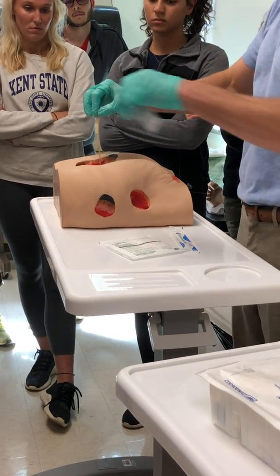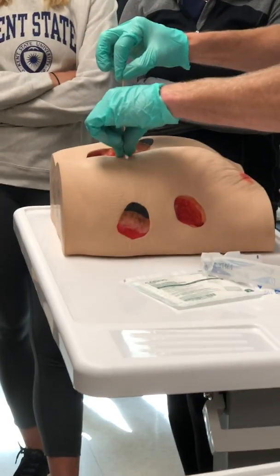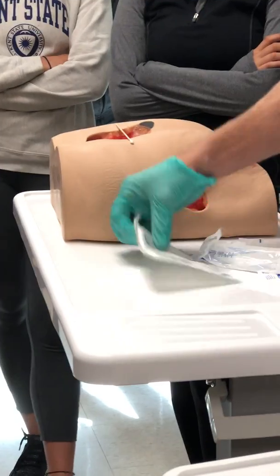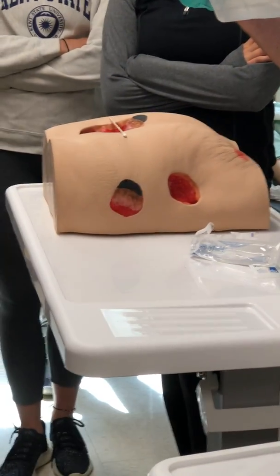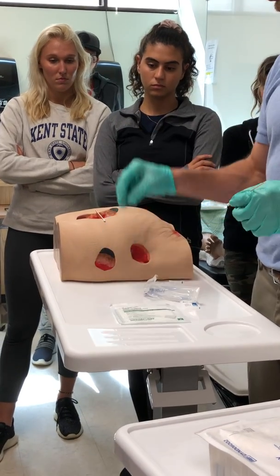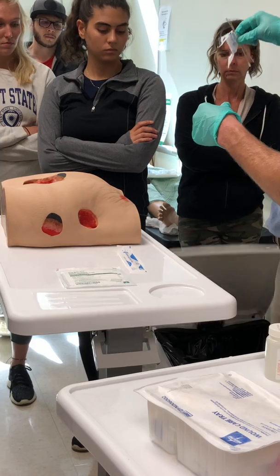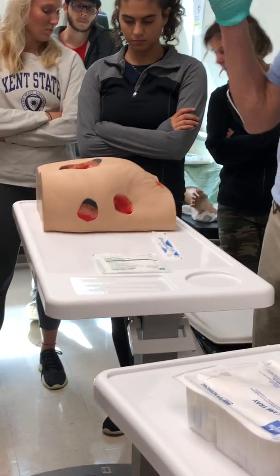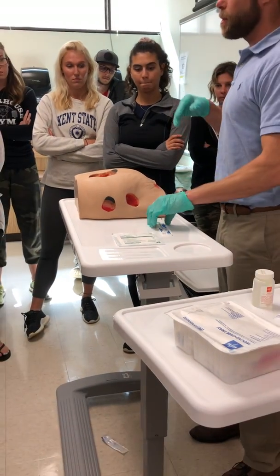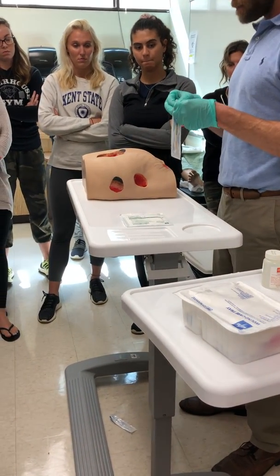I'm going to go down to the deepest part of the wound. It is 3.5 centimeters deep. Is everyone okay with that? These two are no longer good to be used. I like to clean up as I go. I don't ever put my hands below my hips, because when you have sterile gloves on, which I don't currently have on, I can't go below my hips, so I just practice never doing it. And then I clean up when I'm done.